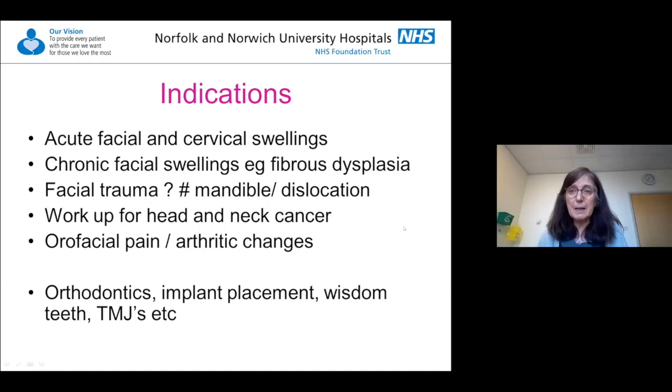For a couple of reasons, really. One, to assess the dental state of the patient, such that if they require radiotherapy, we know that they're not going to need, soon after that, numerous extractions which could cause complications. But the other reason is you can sometimes see evidence of bone resorption on an OPT. So we use it as a primary investigation for oral facial pain. We can sometimes see arthritic changes in the temporomandibular joints, and a lot of dental bits and pieces such as orthodontics, implant placement, wisdom teeth, TMJs, etc.